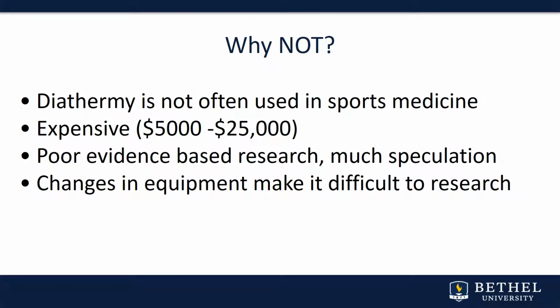Why would we not use diathermy beyond contraindications? Well, partly because it's really expensive. You can find small units from around $5,000 all the way up to a regular commercial unit, $25,000. So a lot of money.